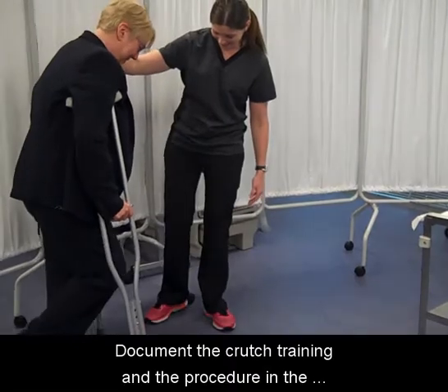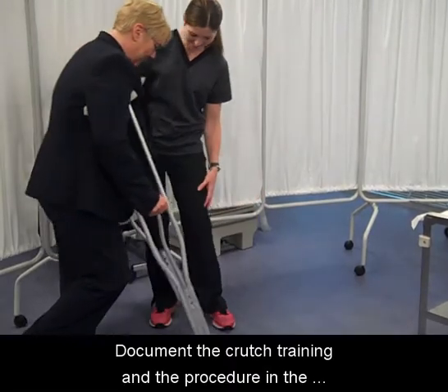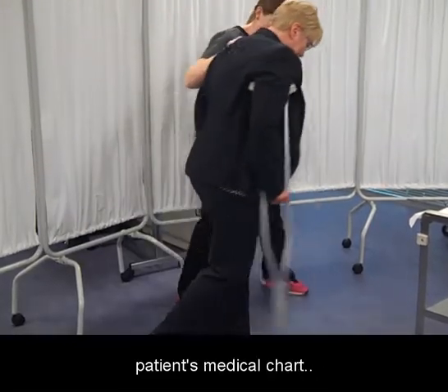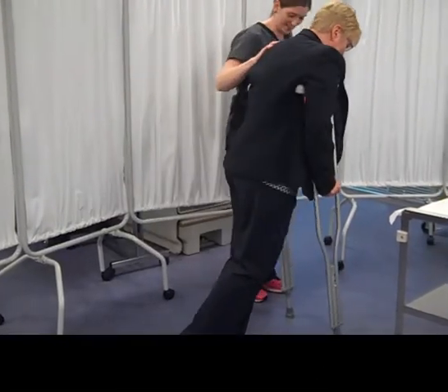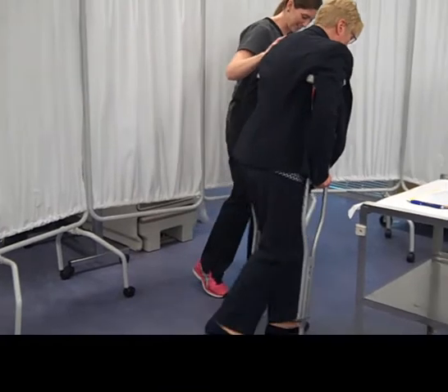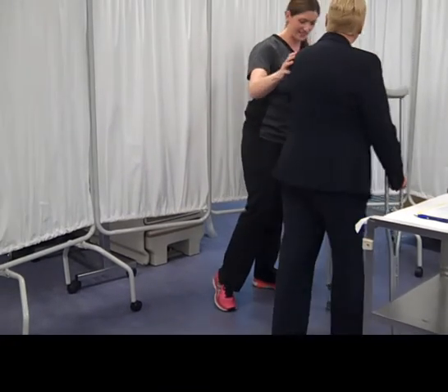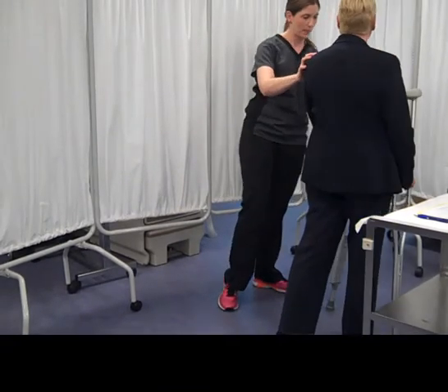Document the crutch training and the procedure in the patient's medical chart.